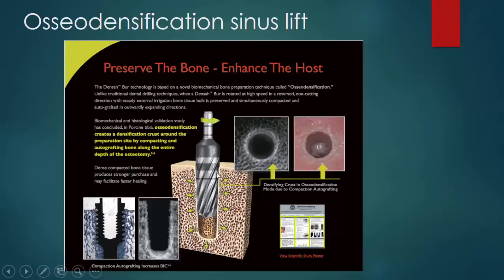فهالسنابل هي بتدور بعكس عقارب الساعة at high speed، ومثل ما شايفين احنا الشفرات تبعها صايرة بشكل طولي وليس بشكل عرضي. فبتعمل لي هي two mechanism، بتعمل condensing للبون وبتعمل also spreading للautografts. يعني هي بتقشط شوي من العظم، وبتعمل spreading للبون condensing للبون laterally and apically. هي بيسموها tornado in the bottle، يعني مثل عاصفة ضمن الزجاجة.